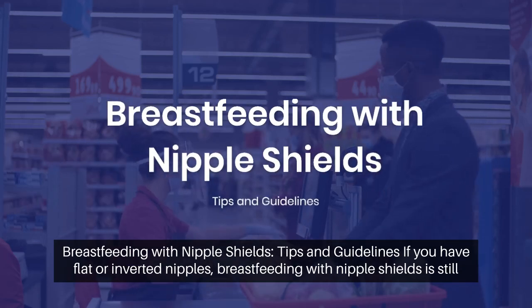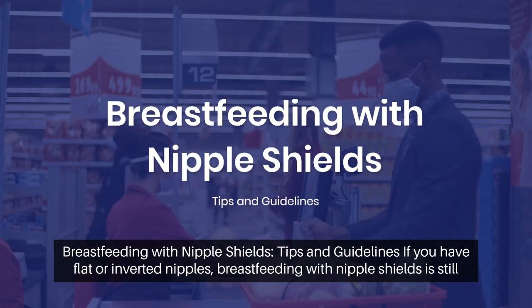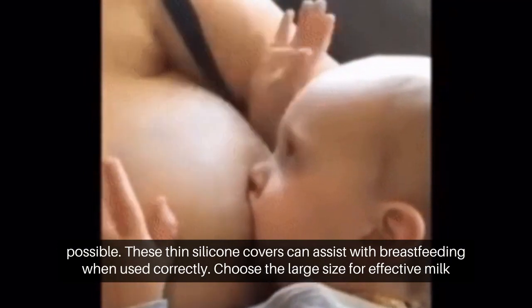Breastfeeding with nipple shields: tips and guidelines. If you have flat or inverted nipples, breastfeeding with nipple shields is still possible. These thin silicone covers can assist with breastfeeding when used correctly.